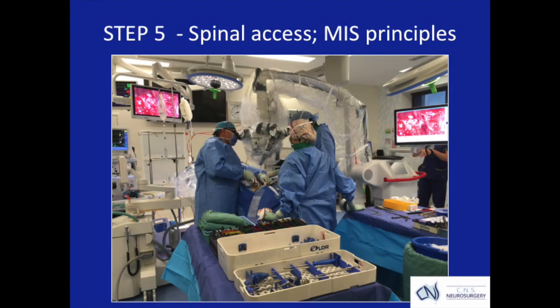Here I am accessing the front part of the cervical spine using a small incision in the neck and minimally invasive techniques.